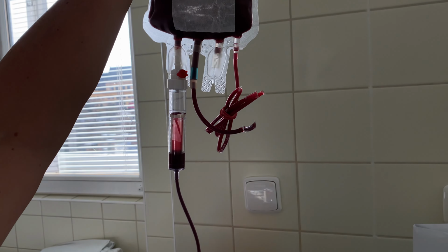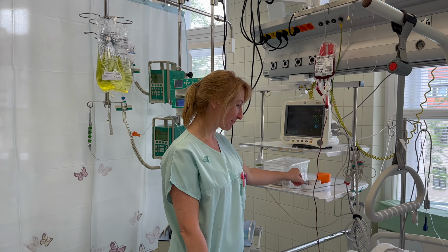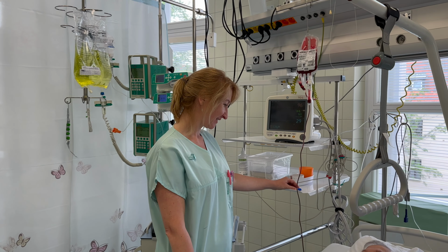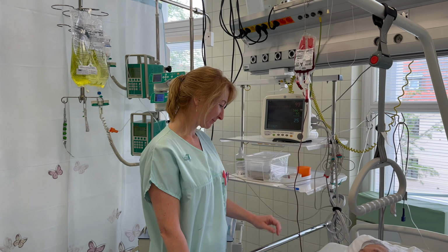During the transfusion, the patient is monitored at 30-minute intervals. These checks are recorded immediately in the documentation. The patient is provided with a signaling device and instructed to report any new symptoms immediately. If any symptoms occur, the transfusion is stopped and a doctor is called to determine the next steps.